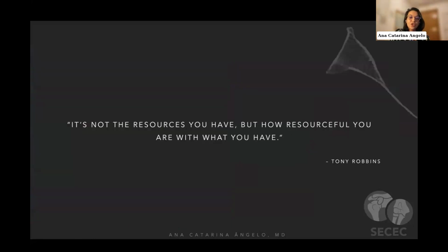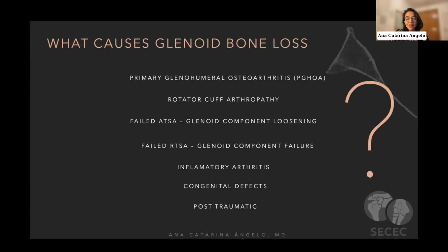But it's not the resources you have, but how resourceful you are with what you have. So here we just have to become resourceful. We have to understand why we have this amount of bone and how can we successfully place an implant in this small amount of bone. So going back to causes, what causes glenoid bone loss? Understand and then act. These are the major causes of glenoid bone loss.